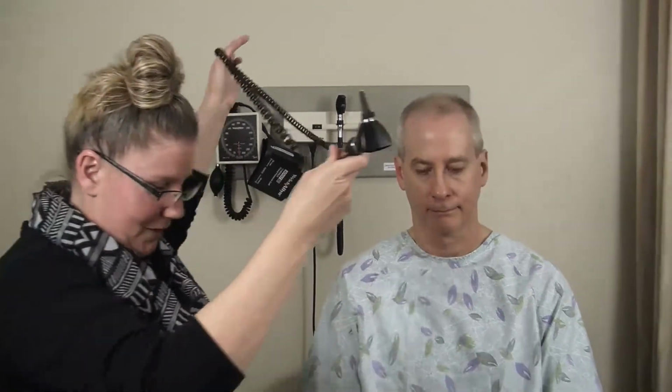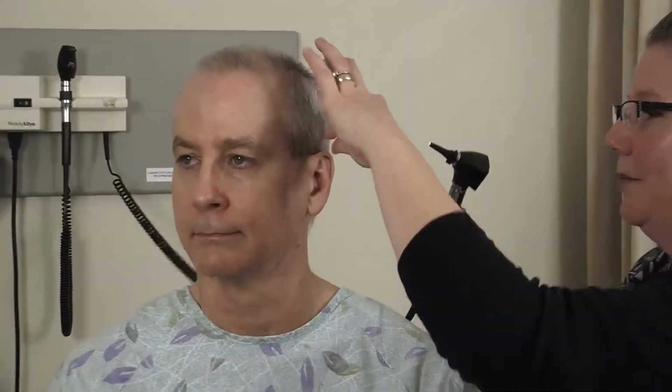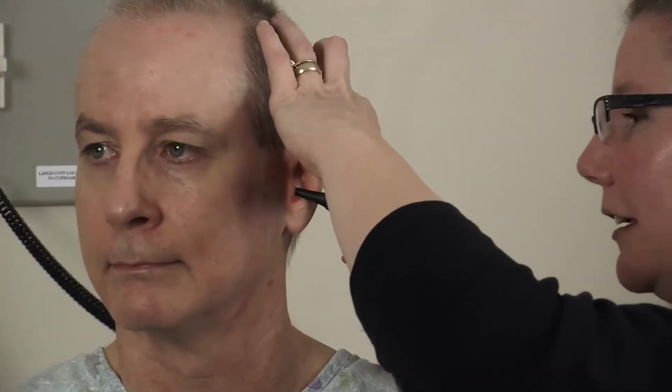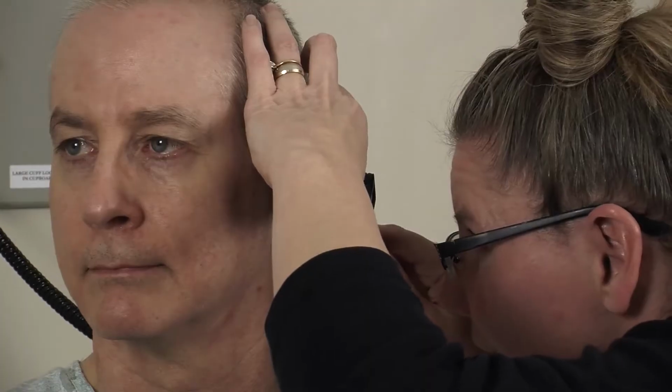And then to examine the other side, you're going to want to keep the cord behind the patient. And again, I'm going to pull up and look in and examine. So that is using the otoscope.